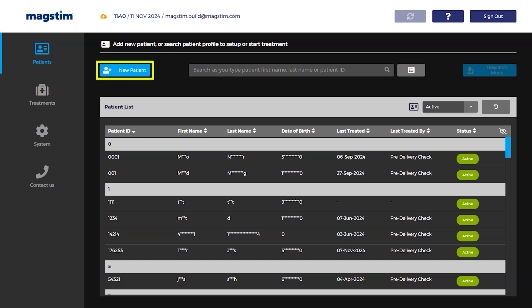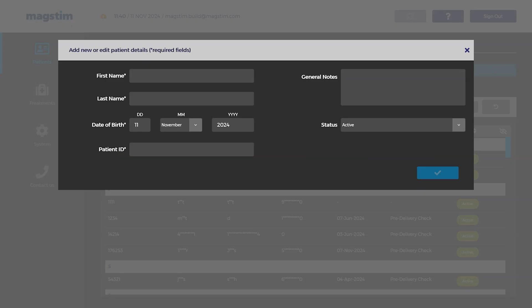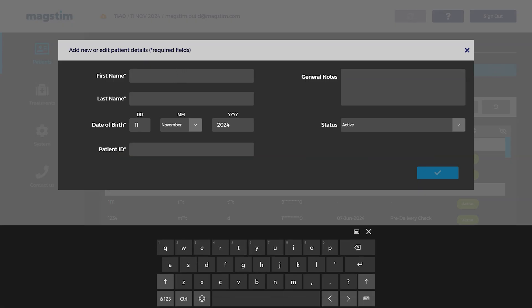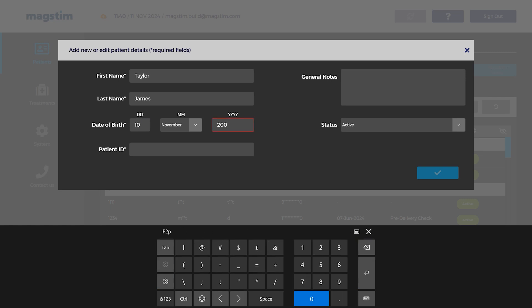Select the patients tab and press add new patient. Enter the patient information: name, date of birth, and unique patient ID. Press the check icon to save.